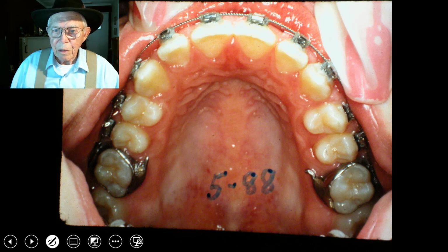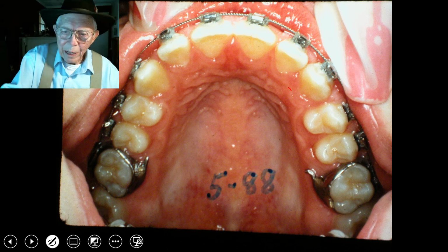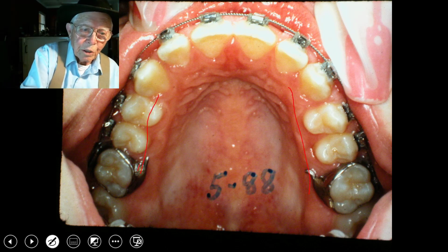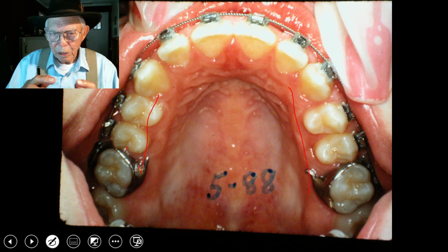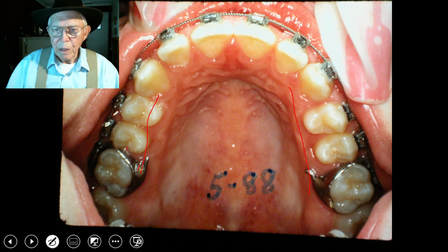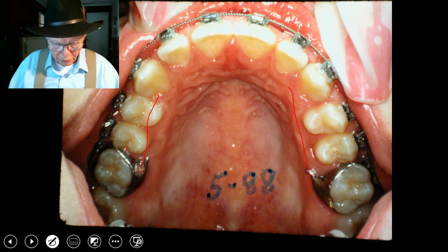And this is the upper, and we've expanded the palate some, and you can see where we've done that to actually get working off of that, and we're pulling on the palatal separator while you're going in there and doing this.